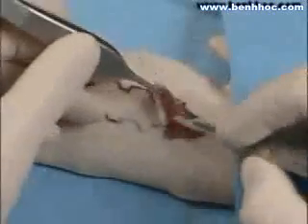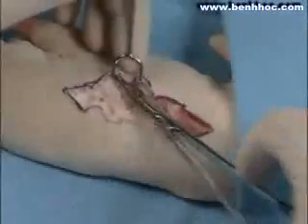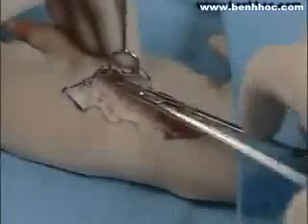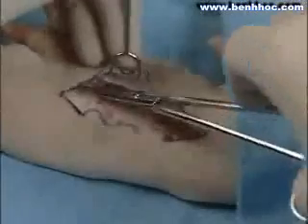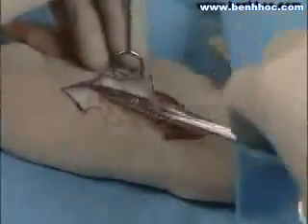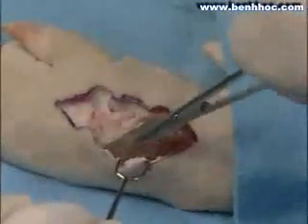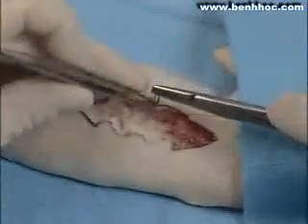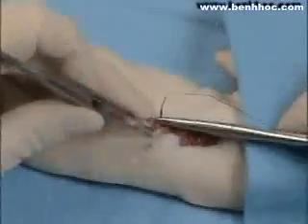Here we can see the undermining, using either a 15 blade or the scissors. Note the double hook, and the third instrument, as it were, is the middle finger of the surgeon's left hand, while the scissors are dissecting using the tip upward technique so as not to cut any of the important deep structures. Once these tissues are well mobilized, then the surgeon will try to close the tissue by pushing the tissue together. Deep sutures can be utilized if necessary.